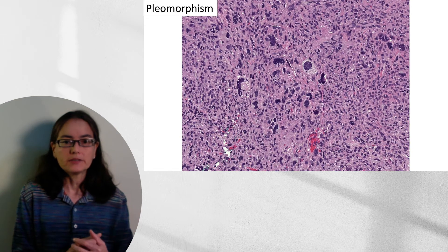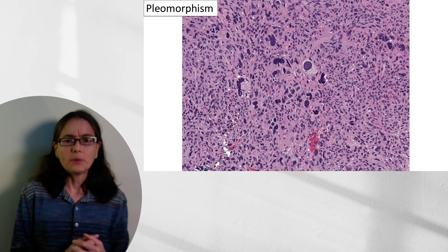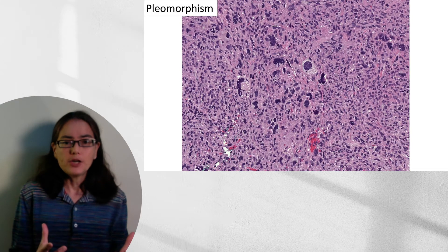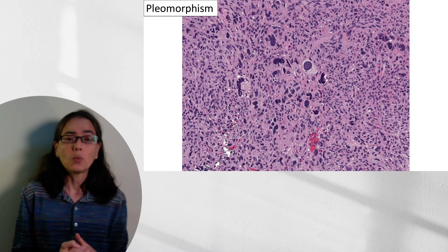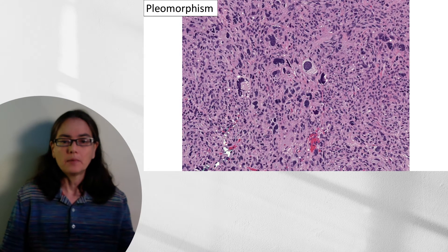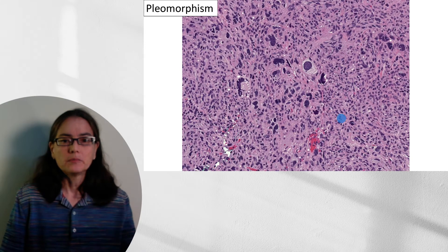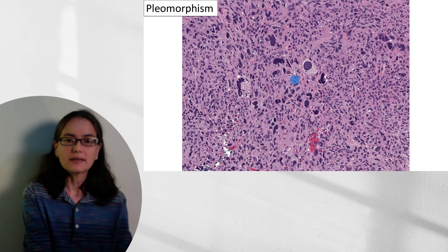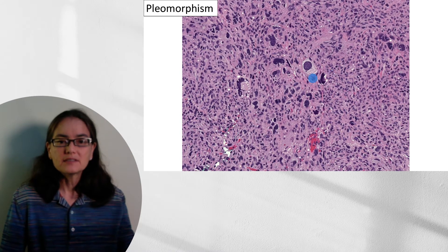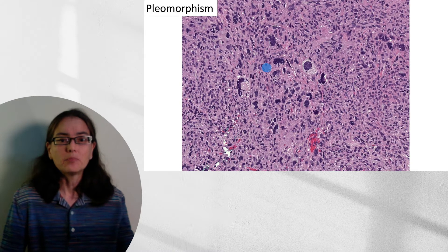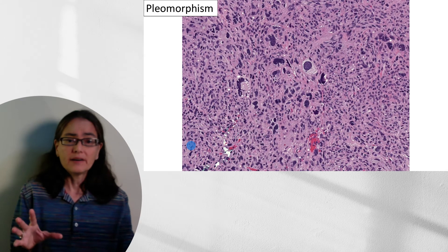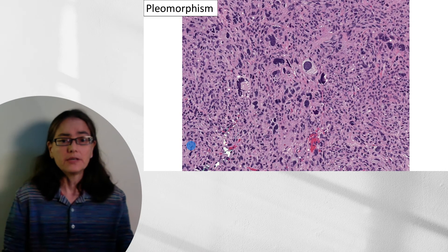Now let's look at what happens when cells have really lost their way — this is what we call pleomorphism. Pleo means many, morphism means shapes, so we have many shapes. This is a beautiful example from a sarcoma. Sarcomas are well-known for showing a lot of pleomorphism when they become high-grade. If I took a tiny biopsy from here and another from another part of the same tumor, I really couldn't say they're the same tumor due to the variability. Here we have a big, dark, convoluted nucleus. If you see something like this on an exam, this is malignant.